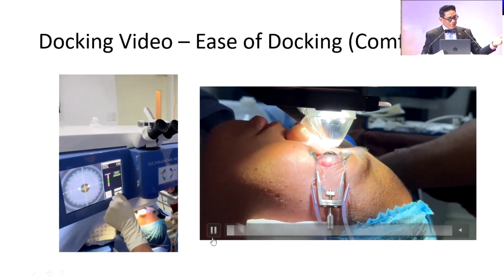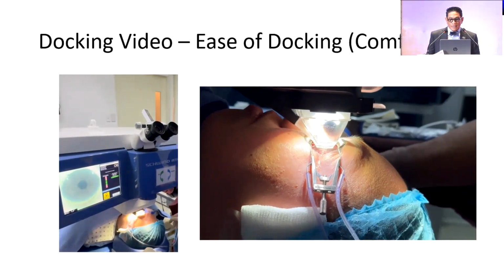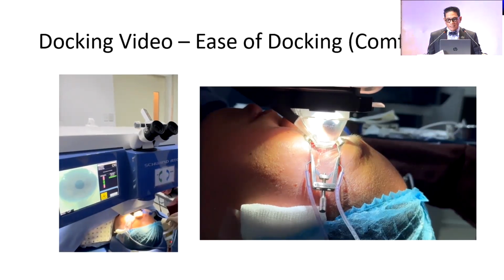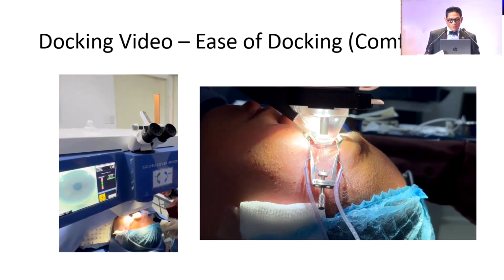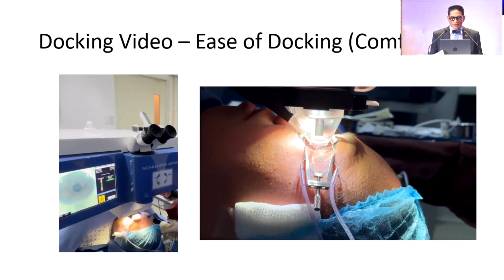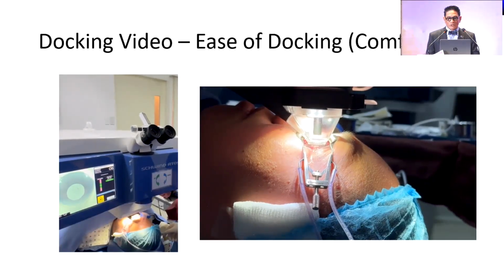So this is just how you dock the patient. I took a video on the lateral side of the patient. As you can see, it really docks the patient. It even presses the eye down, so it's almost impossible to undock the patient. But of course, we're not perfect. The system is not perfect; it can also undock, but because of this, there's less chance of suction loss.